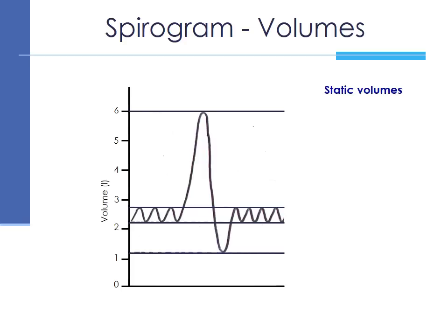This is demonstrated in the graph as these smaller waves, an inhalation and an exhalation. Normal inhalation, normal exhalation. This volume of air represented by this normal inhalation and exhalation is called the tidal volume. And the tidal volume is usually estimated at about 0.5 liters or 500 milliliters.